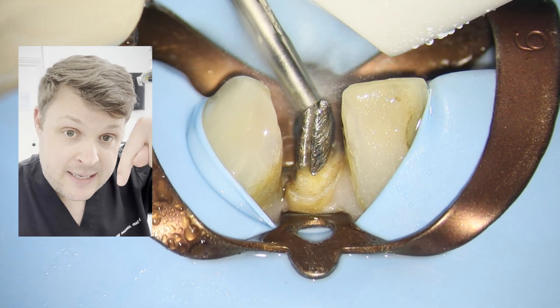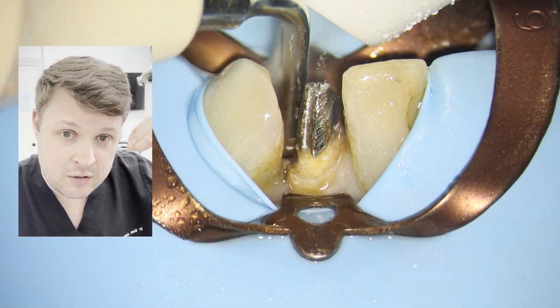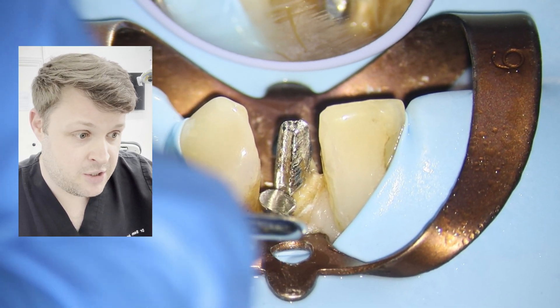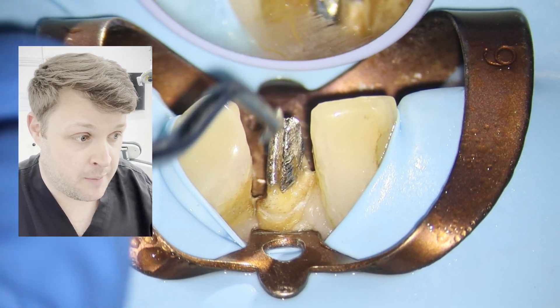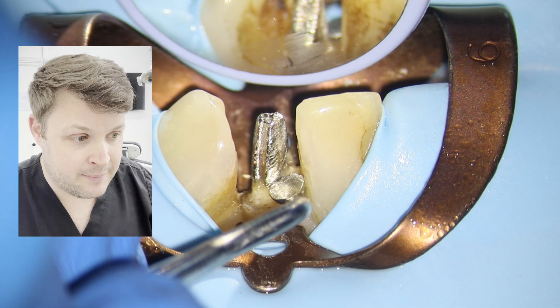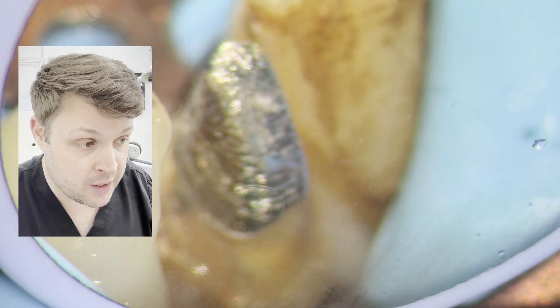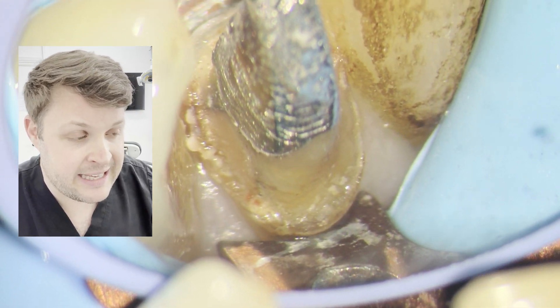As well as vibrating around the sides, the tip has a sort of concave aspect to it and you can activate the post on top of that. I've vibrated it for a little bit — lots of water by the way — and I'm just trying to undermine the post. This is very early on and I'm looking anywhere around this post where I can get underneath it.